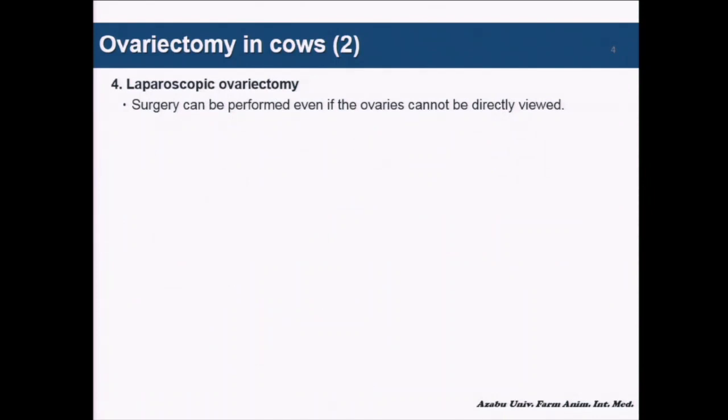On the other hand, in a laparoscopic ovariectomy, the position of the ovary can be confirmed with the laparoscope, making it possible to confirm the extirpation and bleeding reliably, even without direct vision. In addition, a small wound minimizes the pain, consequently reducing the burden and enabling rapid recovery.